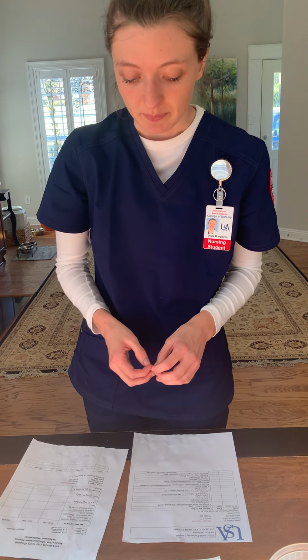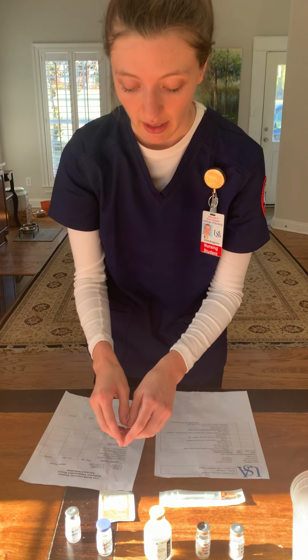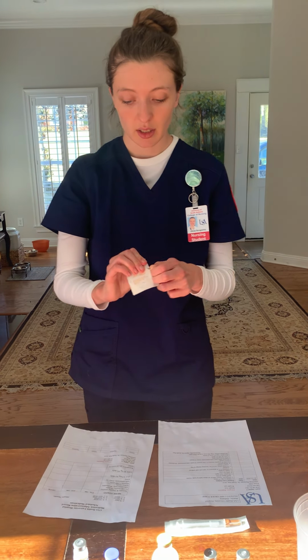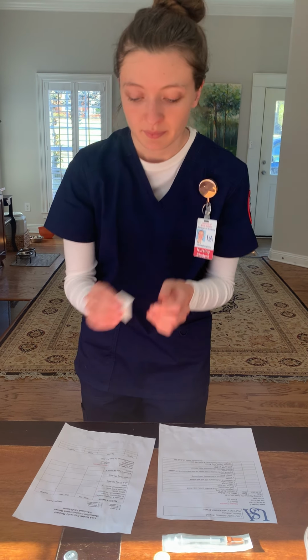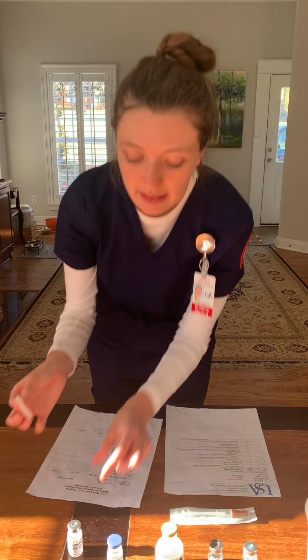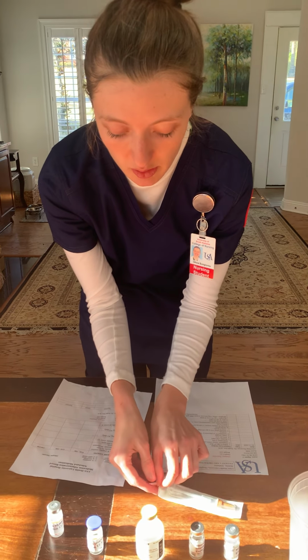And so I'm going to disinfect my vial, discard. I'm going to make sure it is clean, throw that away. I will open my syringe.